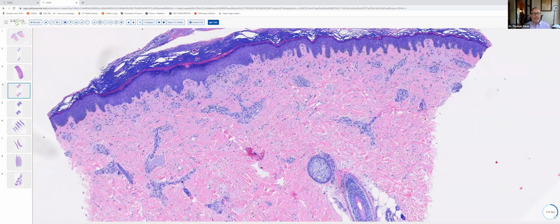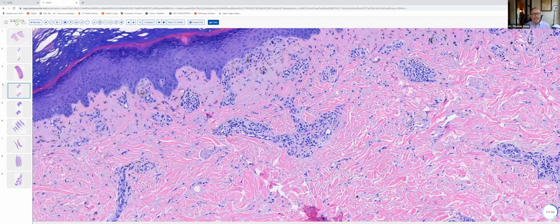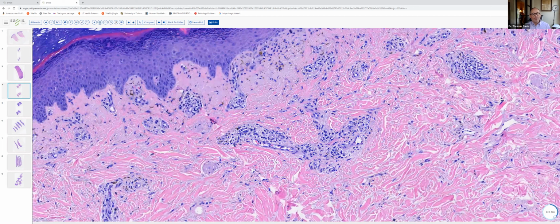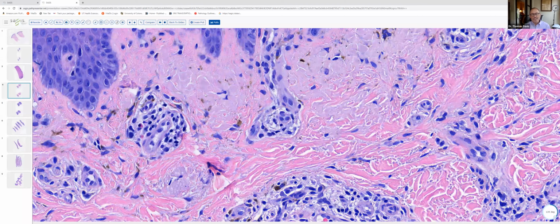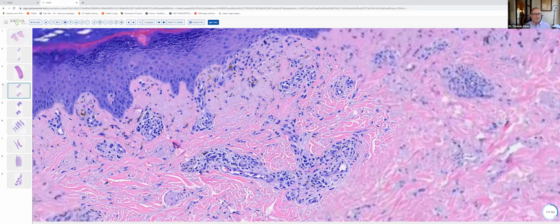And indeed, if you look in the papillary dermis here, you can see that a few of the papillae are widened. And within the widened papillae, there are these amorphous pink and somewhat fissured deposits of keratin-derived amyloid. Typically in amyloid, you're going to see scattered melanophages and a variably dense infiltrate. Here we've got some lymphocytes and some eosinophils within the infiltrate.